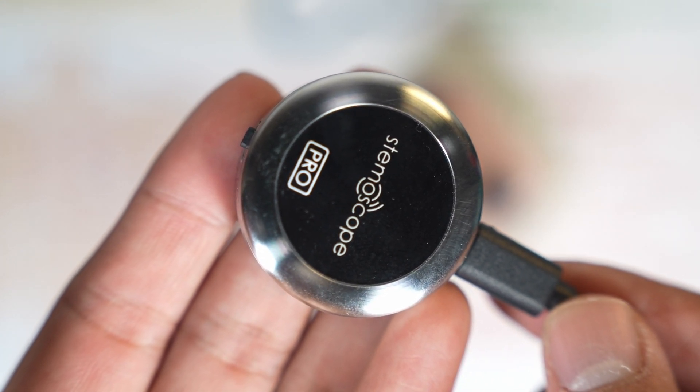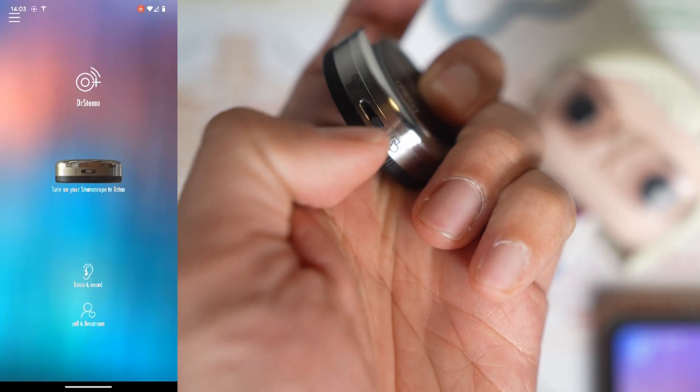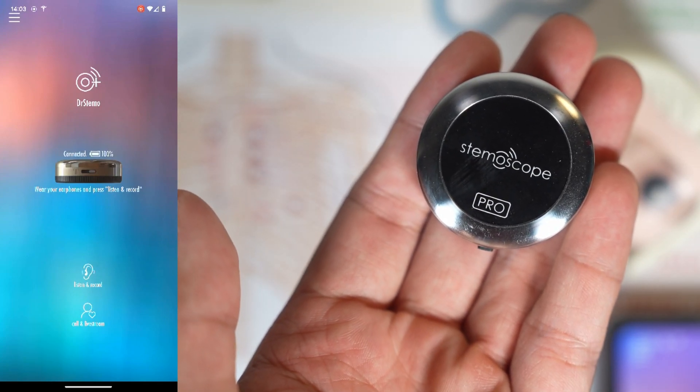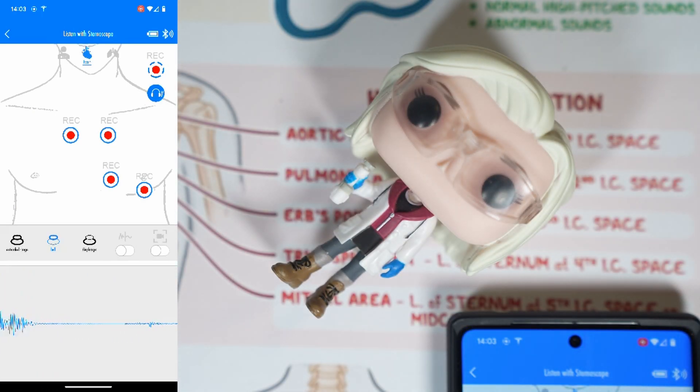To use the Stemascope, you download the app. Set it to connect to your phone. Once connected, you click listen and record, and you can automatically start hearing what it hears. And here's an example of my heartbeat.